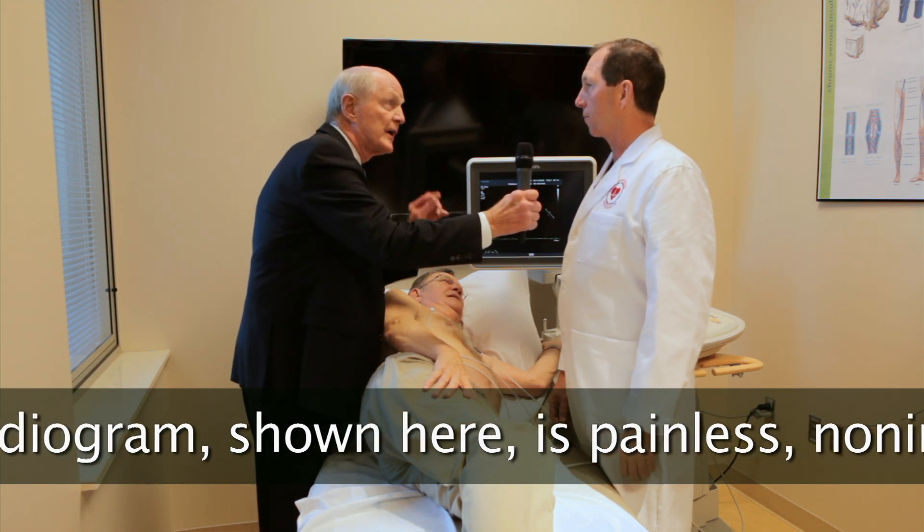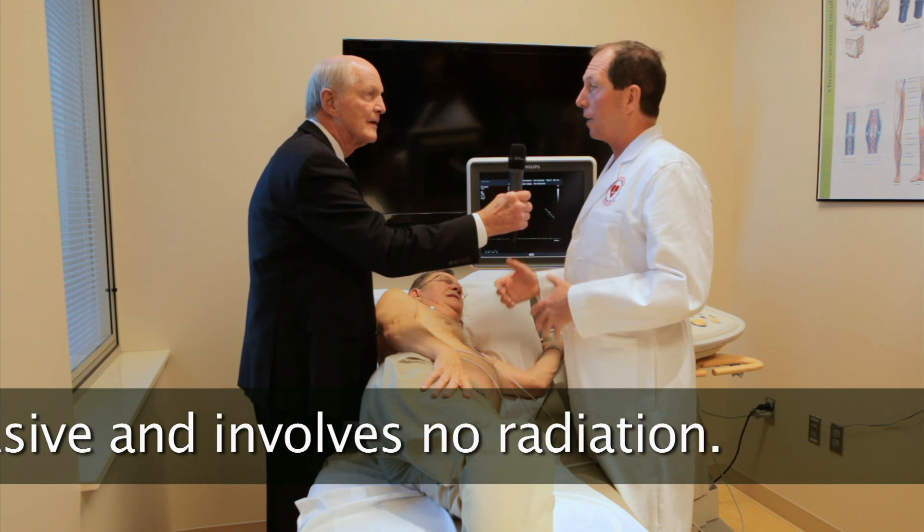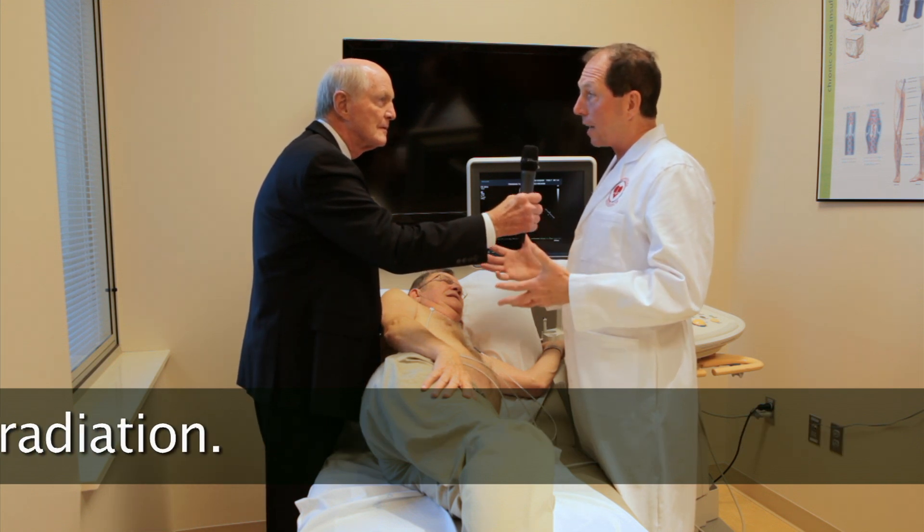So what kind of images are we looking for? Can you see a heart valve? Yes, we see all four heart valves, the heart muscle, the sac around the heart, the aorta, and all four chambers of the heart.